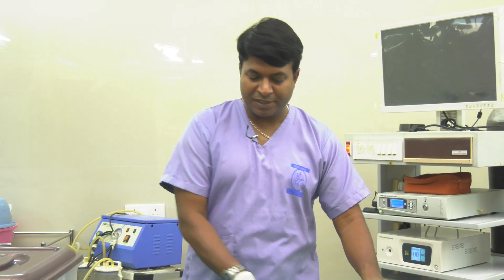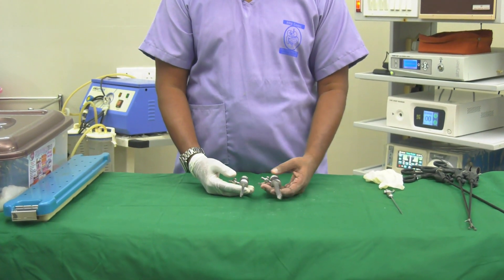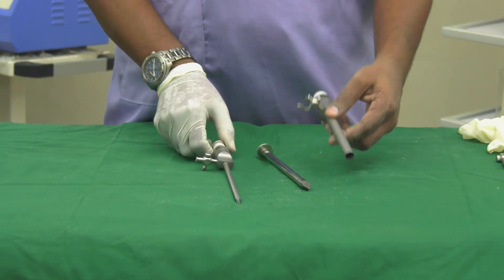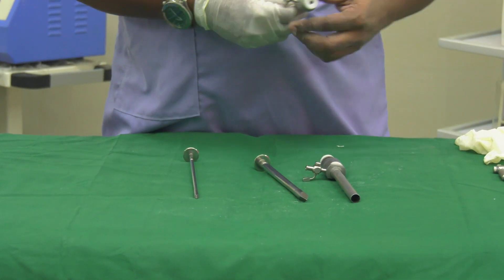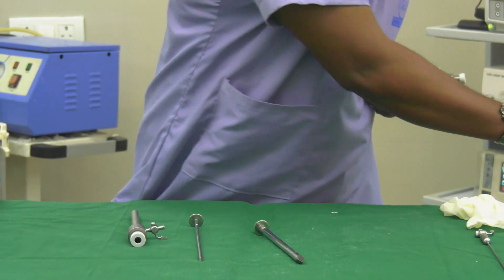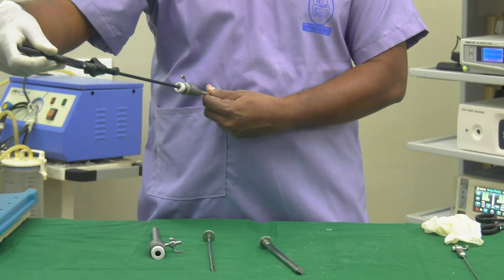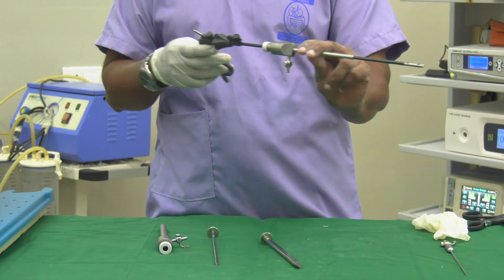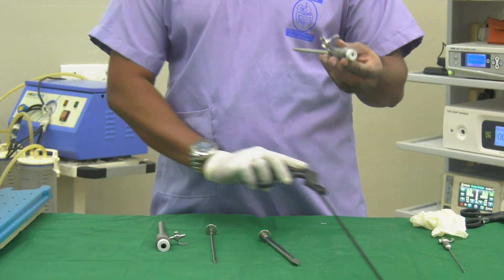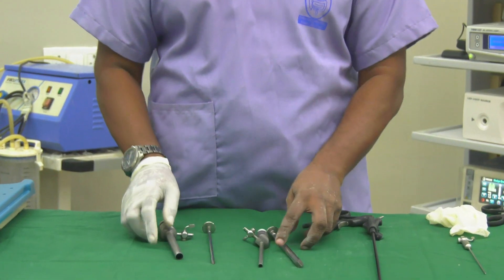These are trocars, which can be blunt or sharp. I have sharp trocars here — this is a 10mm trocar and this is a 5mm trocar. While operating, I place these trocars inside the abdomen and pass the instruments through them. The instruments are designed with a washer so that no gas escapes as they are inserted. We use multiple trocars during laparoscopic surgery.